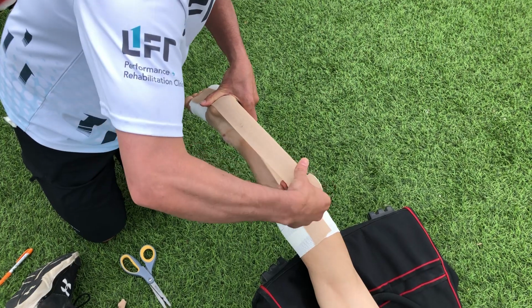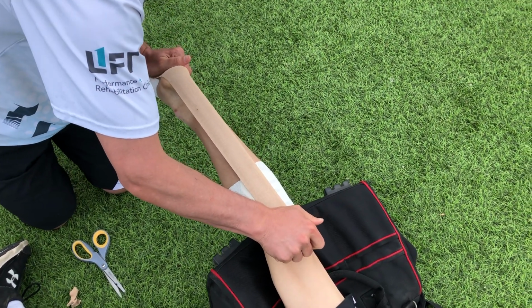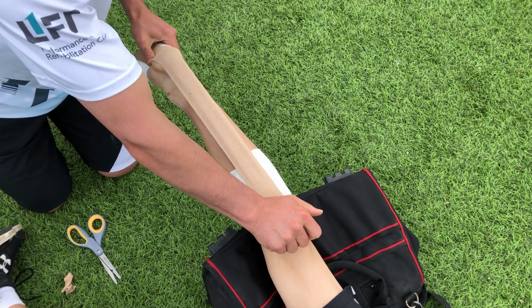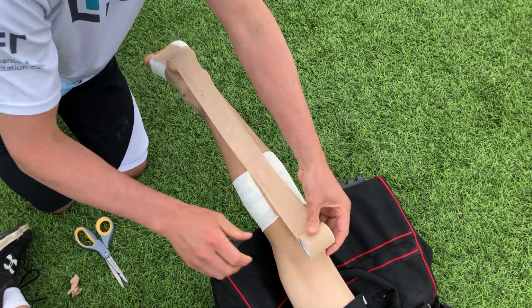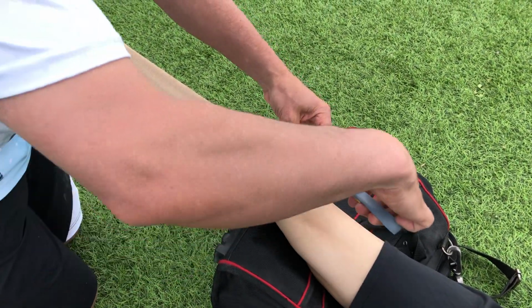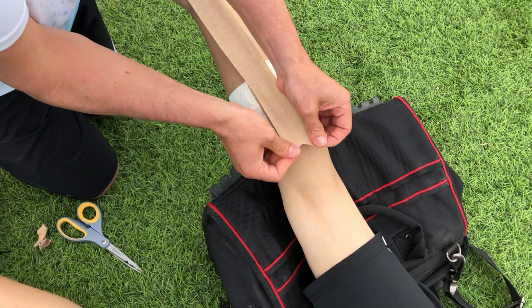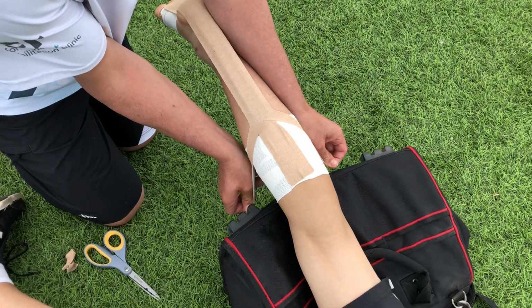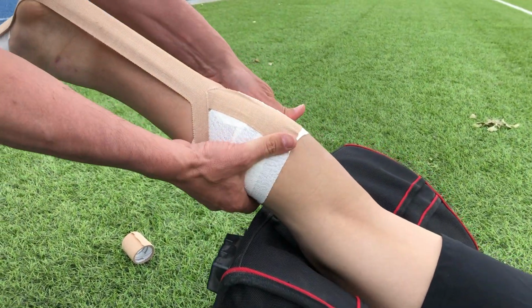Following the same path, but this time we're going to get up to about here. We're going to come in and check that tension. You can relax. We're going to take a little bit of extra tape and split the tape in the middle. We're going to rip the tape and create a bit of a Y, and then wind that around to anchor in the front.